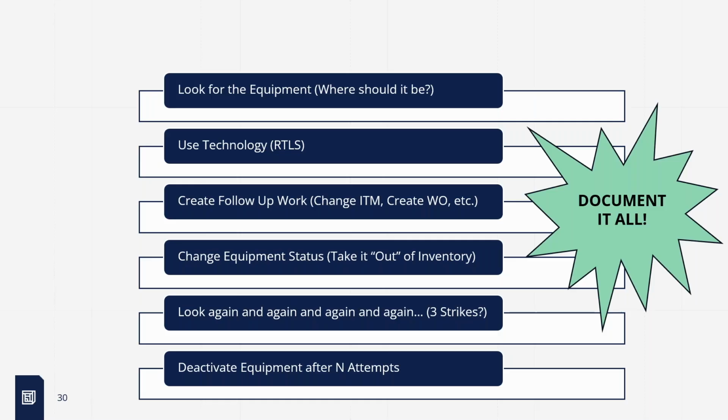Or on a third-party service contract, because we have so many of these devices that we didn't realize we had, maybe we should do some in-house training. So standardization across the board touches so many things. Mass edit is a friend. I know some CMMSs have it, some don't, but mass edit is a good tool.